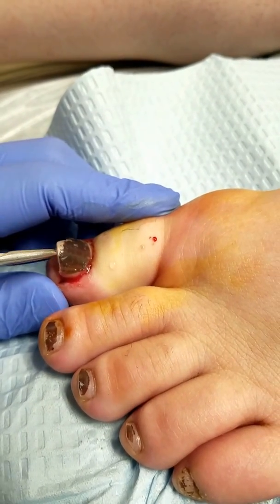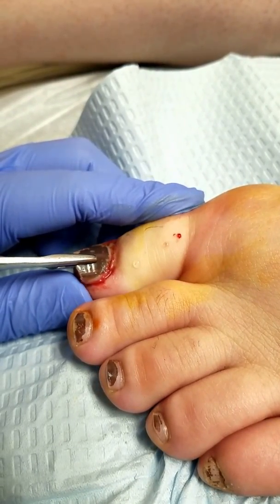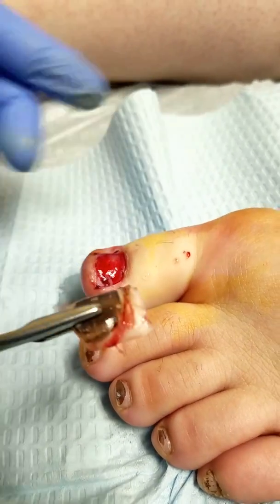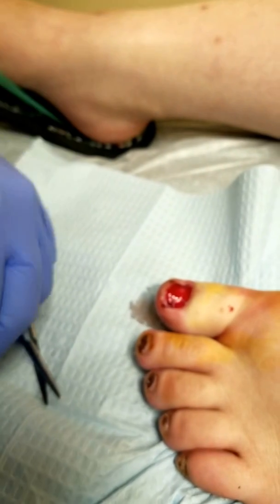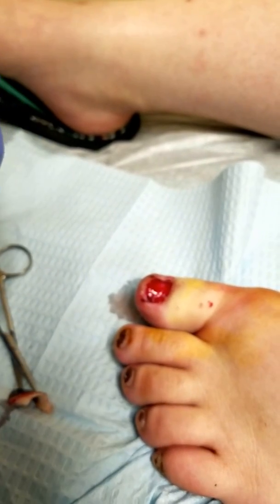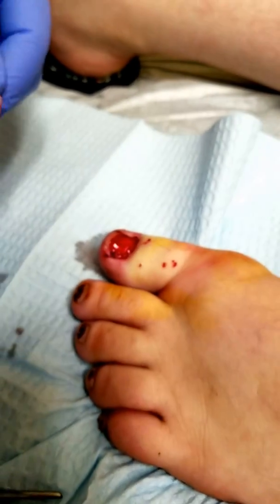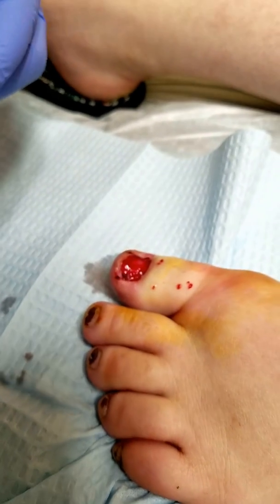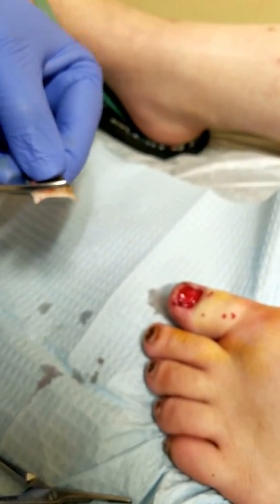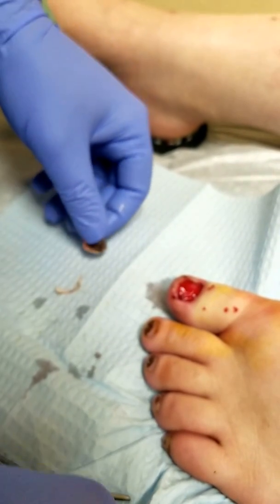I'm super scared. Oh, you're scared? Okay, don't be scared. So it's done. It's done? Yeah, it's done. Are you serious? Yes, I'm very serious. Oh my god. So what happens is we can't keep your toenail just open like this, so we're going to put a little piece of the toenail back, just to keep it open so that a new one can grow in place of it.